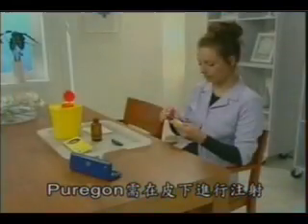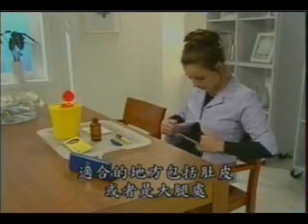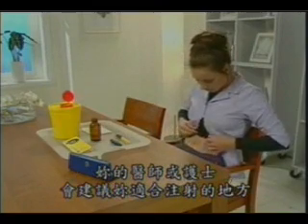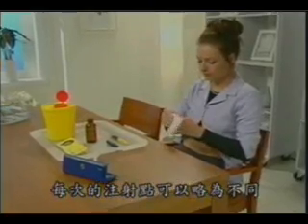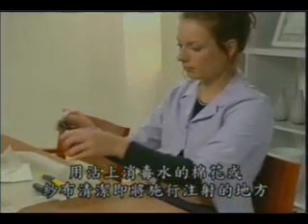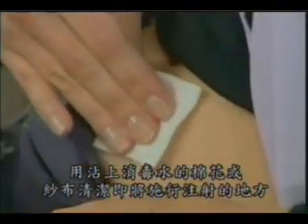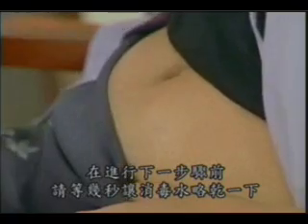Puregon is designed for injection under the skin. Suitable places for injection include the abdomen or upper leg. Your doctor or nurse will advise the best place for you. Try to vary the site of injection just a little bit each time. Use a swab or piece of gauze moistened with disinfectant to clean the area where the needle will be inserted. Let the disinfectant dry for a moment before proceeding.